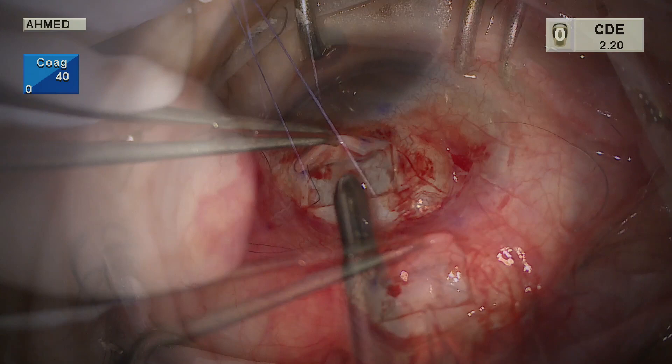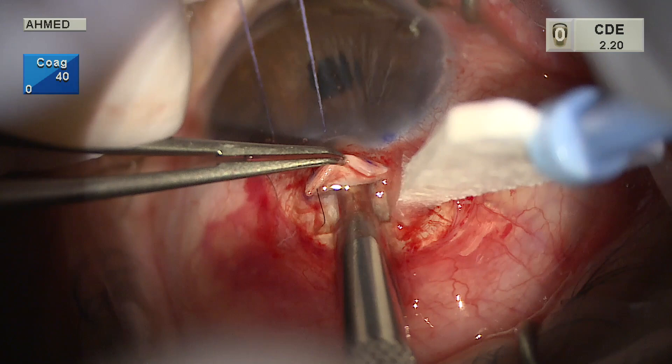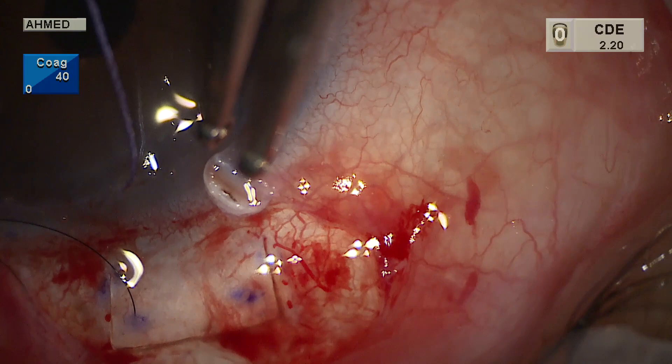The incision is advanced left and right to open it up, entering anteriorly in the clear corneal zone. A Gills-Welsh or Descemet's punch is used to create the ostomy, taking more of the cornea than the sclera to create a more anterior ostomy. The radial incisions don't go all the way into clear cornea, which creates some resistance anteriorly to prevent anterior flow.